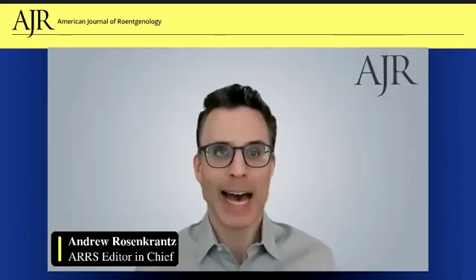Right. And just what kinds of exams were these? Yes, it was heterogeneous, but they were all CT examinations interpreted by a neuroradiologist. There was a group of contrast enhanced CTs of the neck, done, for example, for head and neck cancer surveillance or staging. There were some CTAs done for suspected dissection or suspected stroke. And then there were some trauma CTs, also cervical spine or thoracic spine, including the area of interest.